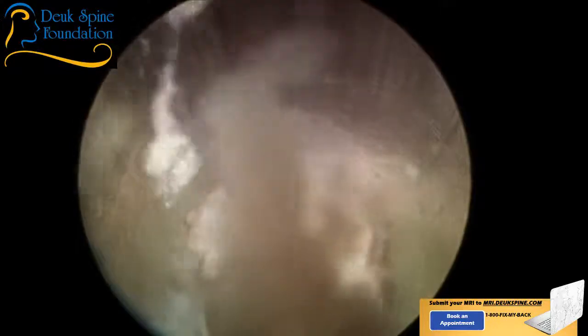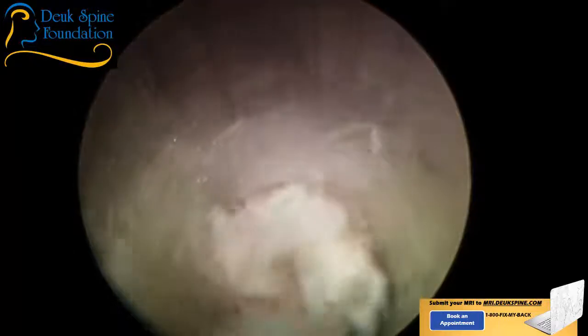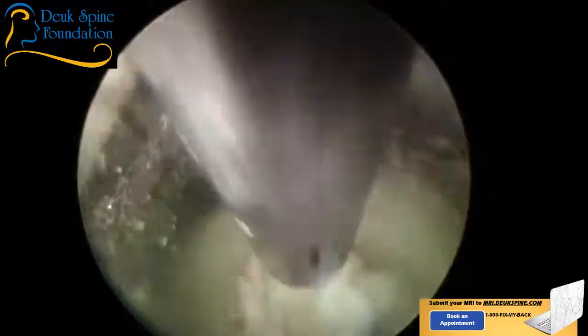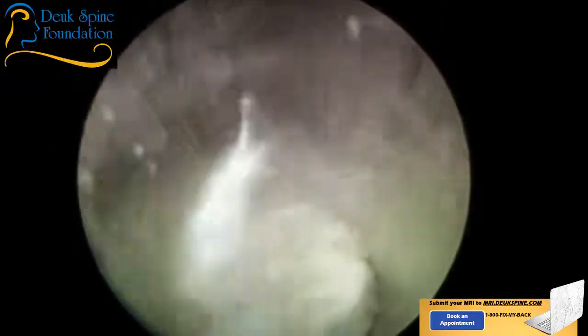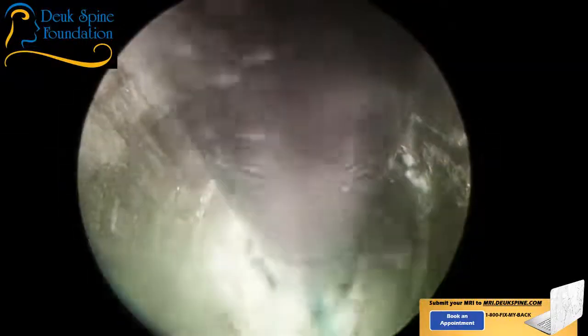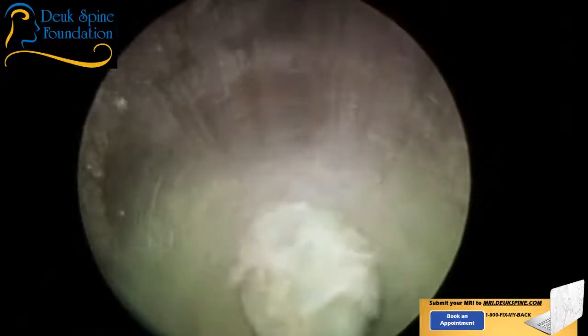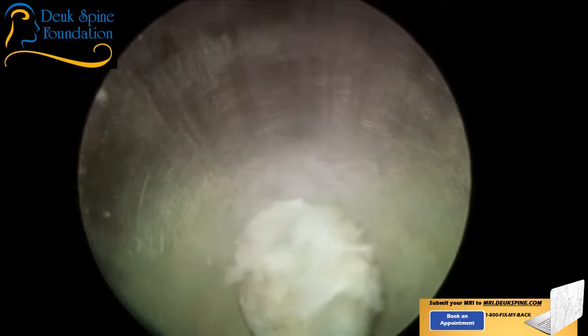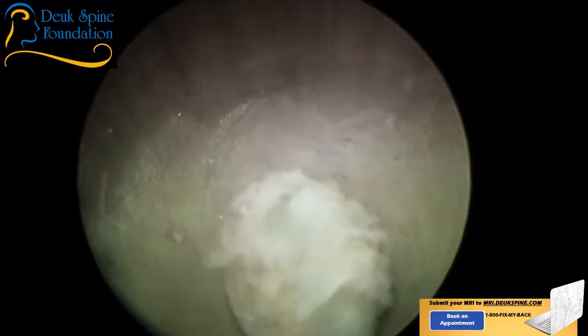Come on, quick. Get your cotton ready, your Raytech. See if I can grab any of this herniation out. Yeah, there's a piece. You got one swipe. There's not a lot of time. Oh. Here's another little piece. Take it. Give me the laser. All right, we need the laser on.